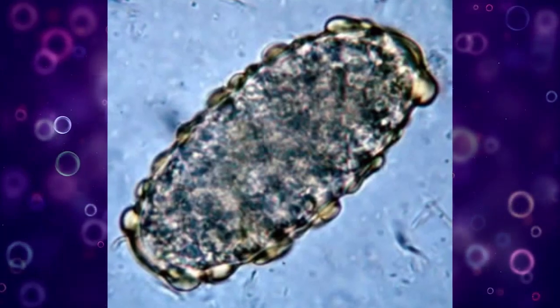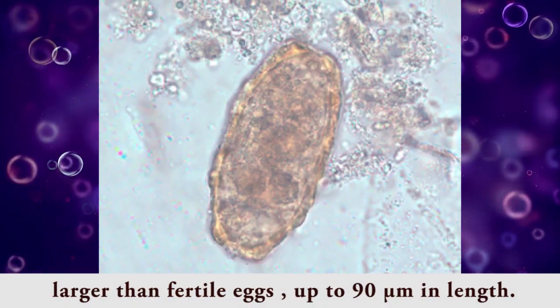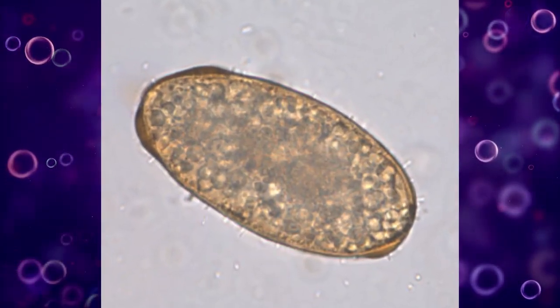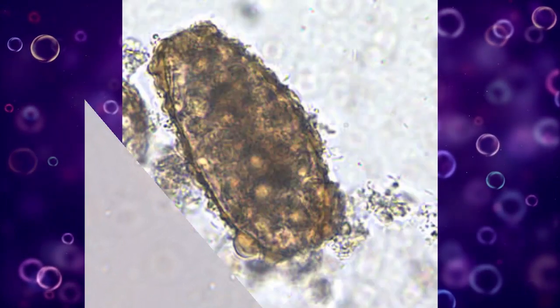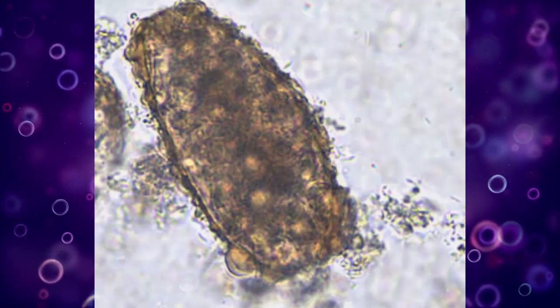Unfertilized eggs are elongated and larger than fertile eggs, up to 90 micrometers in length. Their shell is thinner, and their mammillated layer is more variable, either with large protuberances or practically none. Unfertile eggs contain mainly a mass of refractile granules.